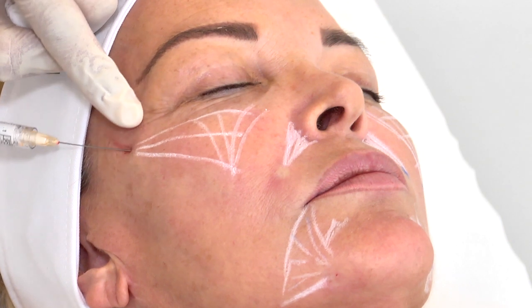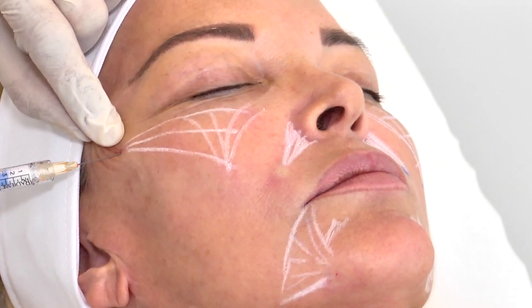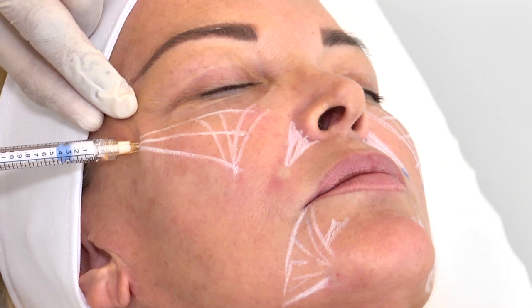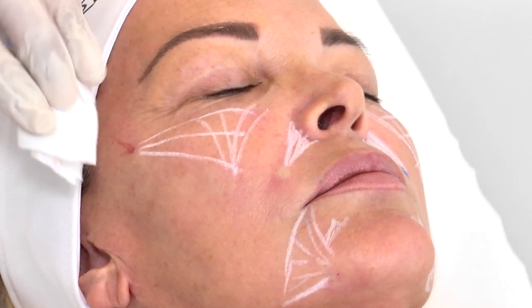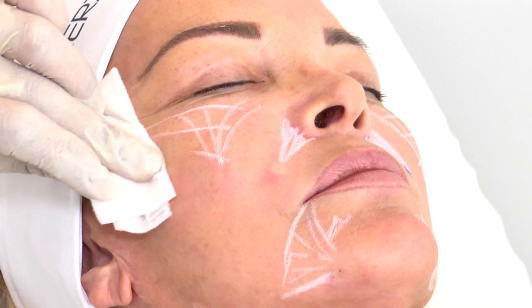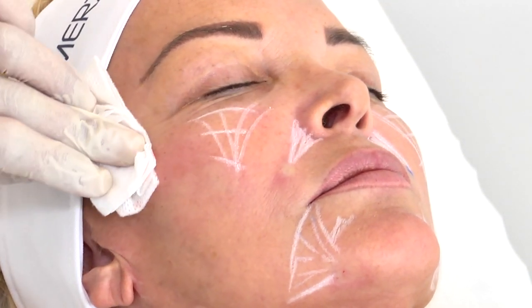The fanning technique can be combined with the sandwich technique on several planes depending on volume restoration required, with the netting technique, with the fan starting at the second insertion point slightly lower than the first. The cheekbone can also be injected using a needle by these same techniques or the adjacent bolus techniques, the pillar technique, when volume loss requires greater projection.